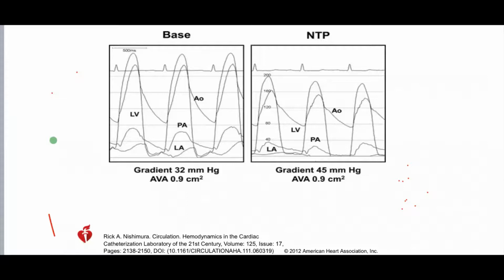Impair. Very good. So if I have more LVH and more impairment of diastolic function, how about the flow across the aortic valve? Will be low, yeah.